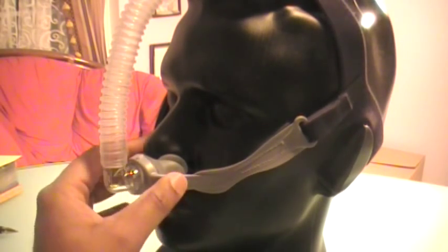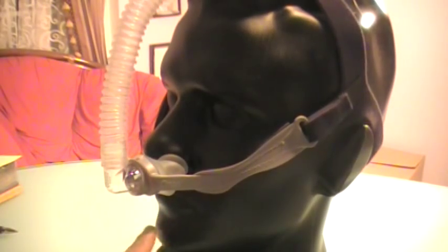This is designed for somebody who is a nose breather, not a mouth breather. If you open your mouth, you need to use a chin strap, or you would have to use a full face mask if you cannot use a chin strap.